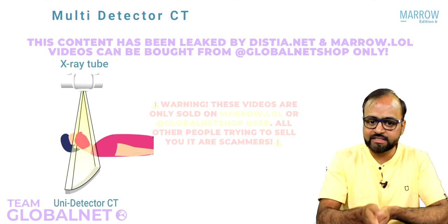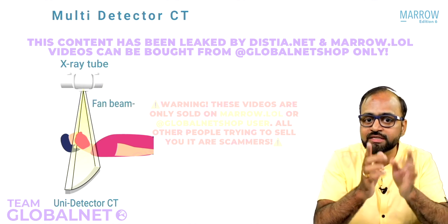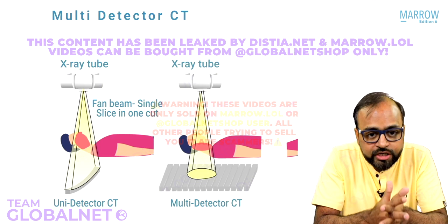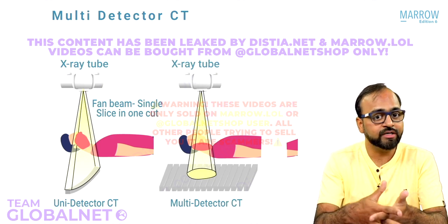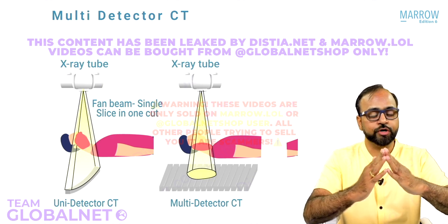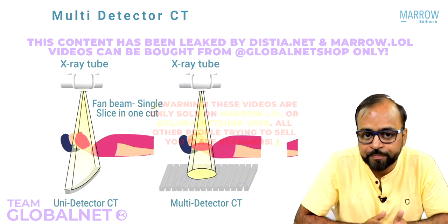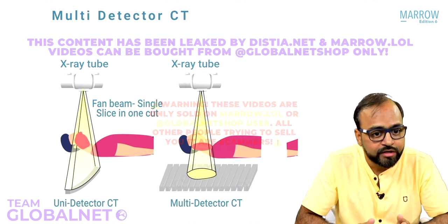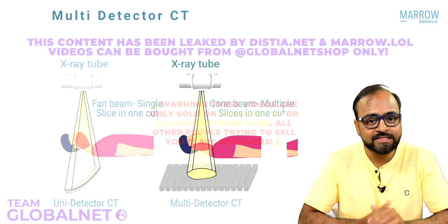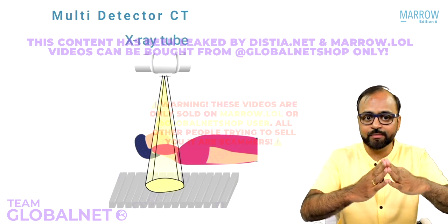When a fan-shaped X-ray beam cuts across the patient's body, it is going to cut through a single slice of the patient's body. But as against that, a cone-shaped X-ray beam, which is used in multi-detector CT, has a third dimension along the long axis of the patient's body. So when a cone-shaped X-ray beam cuts across the patient's body, in one cut, it is going to acquire multiple slices. As this third dimension of the cone keeps on increasing, multiple slices can be acquired.